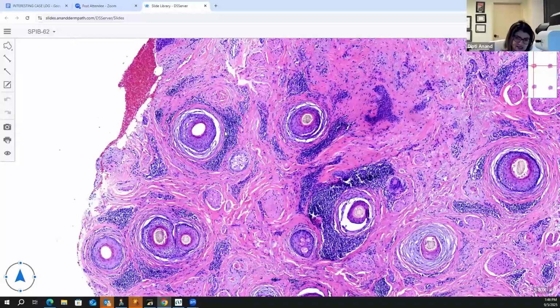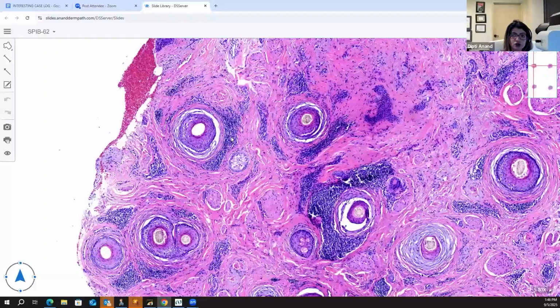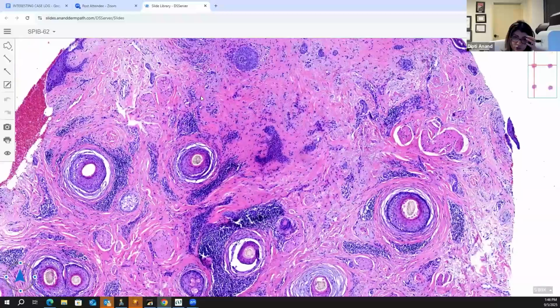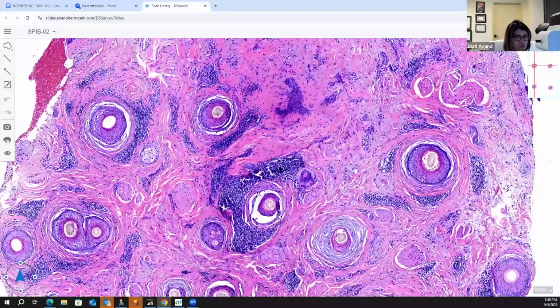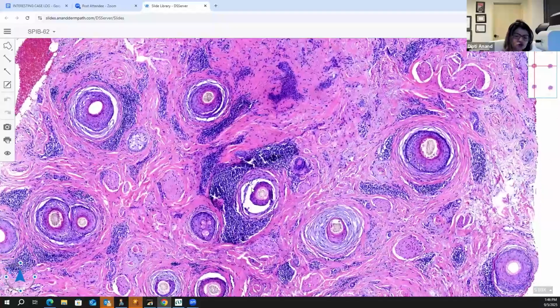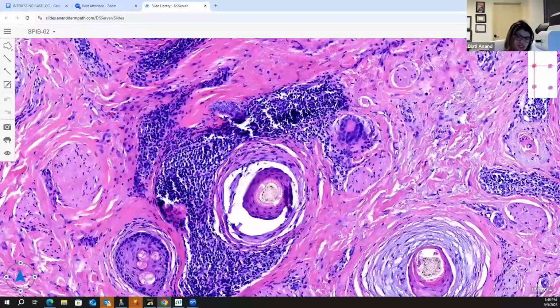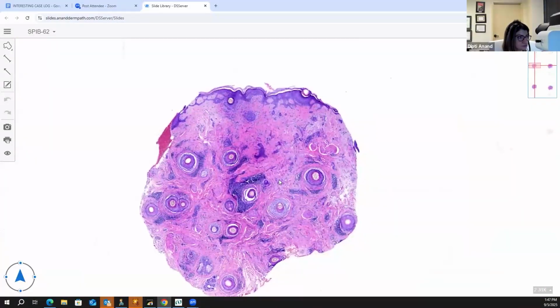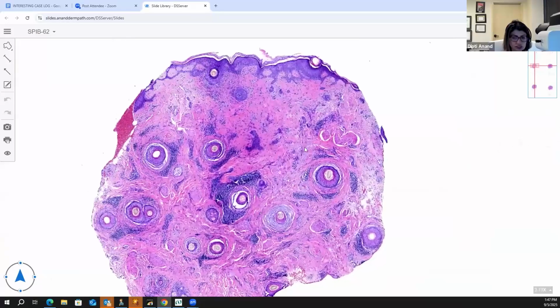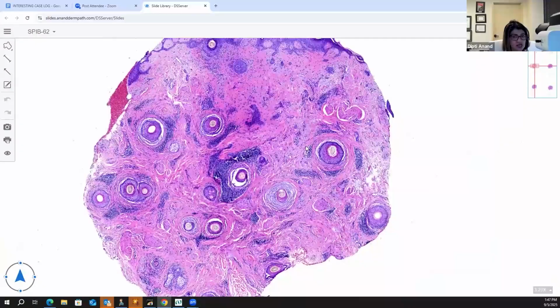So and then this, the perifollicular this. Lupus will never do this. And also in inflammation, lupus has much more prominent inflammation around the vessels. And if it is around the follicles, which it often is, it will not be accompanied with this. This is almost like the max dose of it. So that is why this is not lupus, this is LPP. This is a very important slide. Do you guys get that?